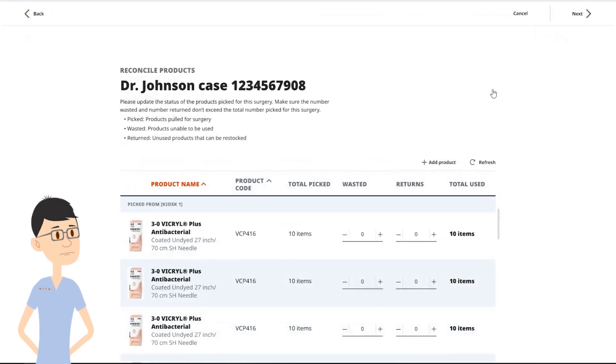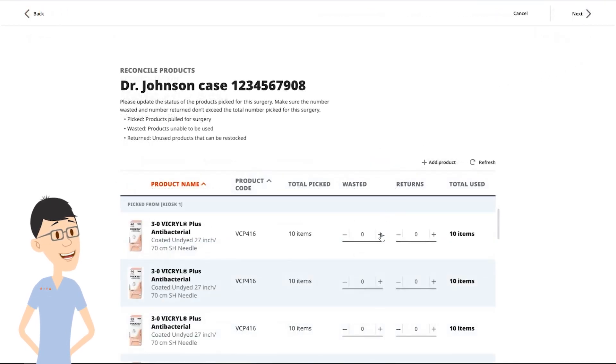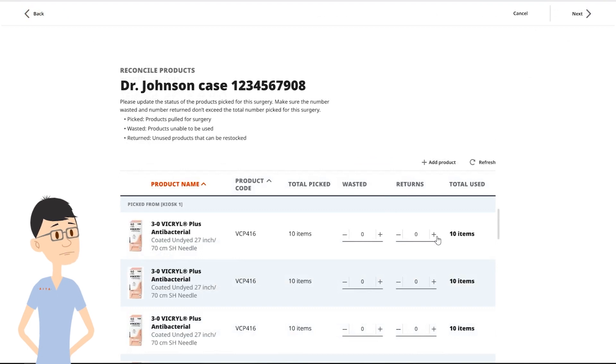Here, you can enter the number of sutures wasted during a procedure and the amount that will be returned.